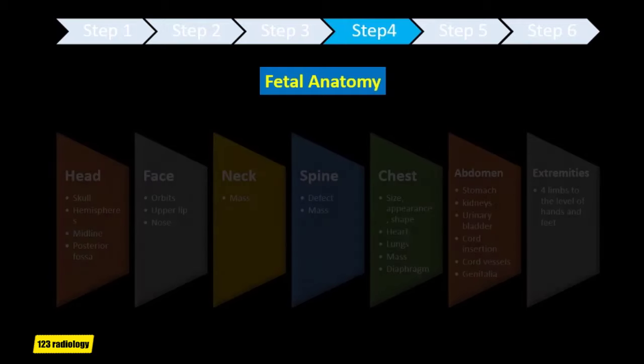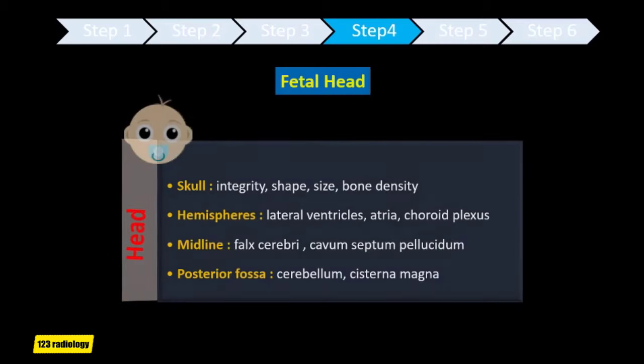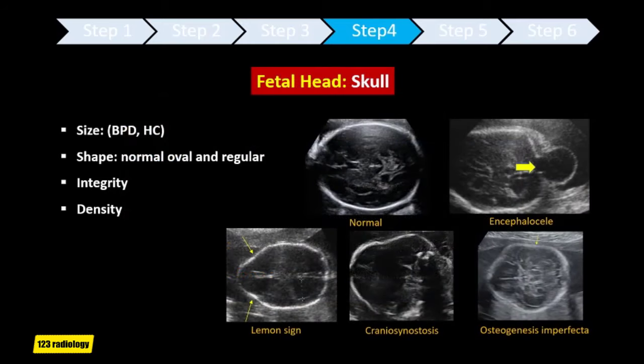Fetal anatomy survey includes the head, face, neck, spine, chest, abdomen, and extremities. For the fetal head, you look at the skull, the hemispheres, the midline, and the posterior fossa. The shape of the fetal head is normally oval and regular, with no defects such as encephalocele, no flattening such as the lemon sign of Chiari II malformation, and no deformations like craniosynostosis. Normally the skull darkens the view of the brain — if brain details are seen too clearly, this may indicate osteopenia, as in osteogenesis imperfecta.